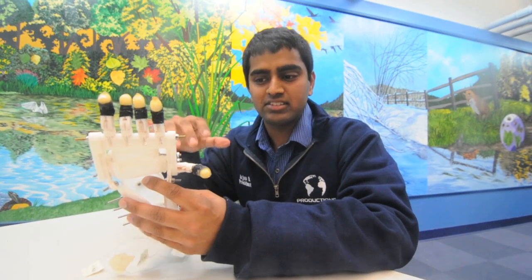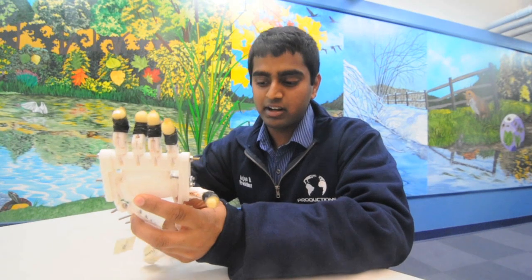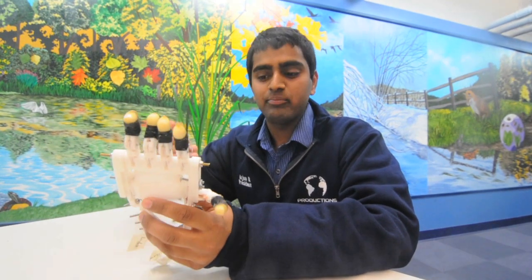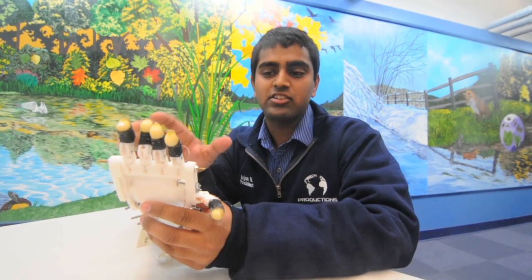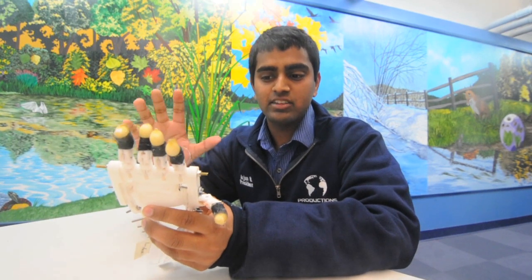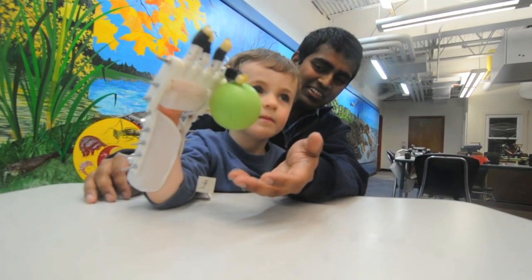When he bends his wrist, he'll actually be able to — I can simulate it now — you can see one finger bending right now. What we've noticed is that it's a lot of tension for a three-year-old to bend his wrist, so we actually only have two or three fingers working right now. But the idea is when he bends his wrist, the whole hand bends and goes toward picking up an object, and as he raises his hand up, he can actually let the object go.